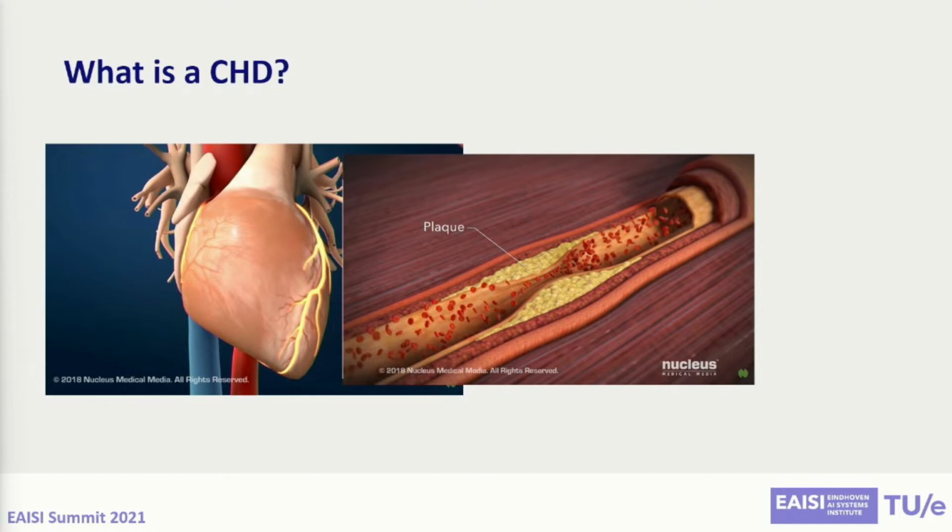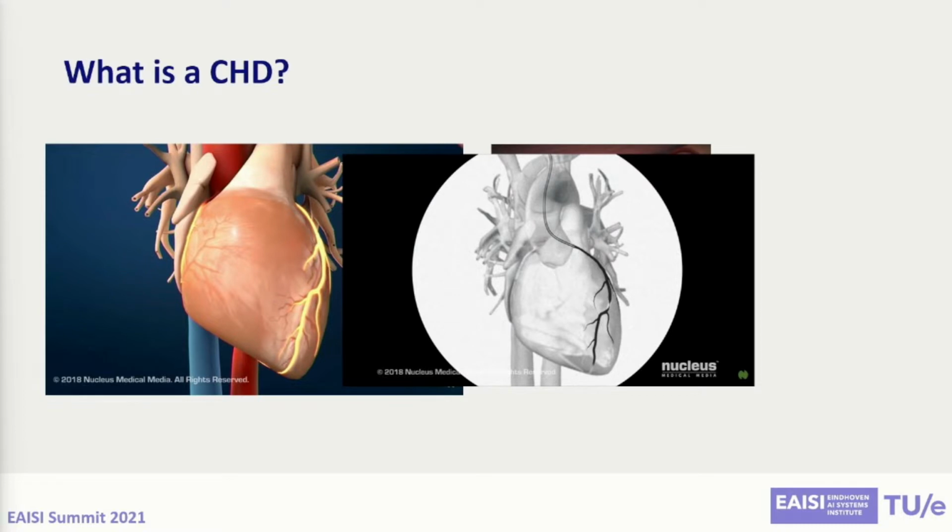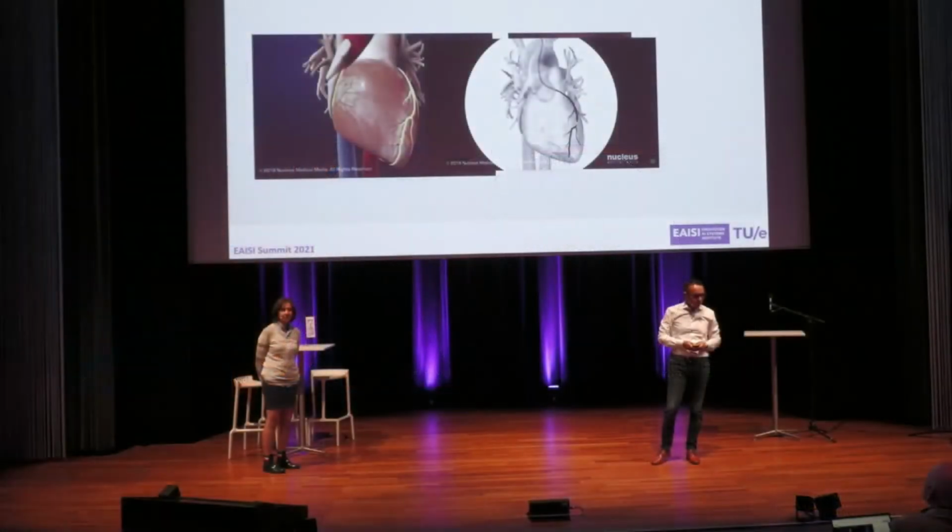So, talking about computer vision, with an X-ray machine, the doctor is actually going to look at your heart, inject a special type of dye, substance, and he will actually notice that there is this blockage in the artery. So then he knows actually that you have formed this plaque in your artery. This is the diagnosis. So what happens next?